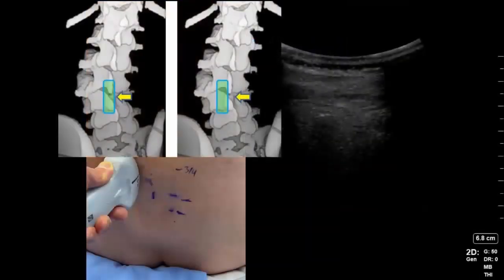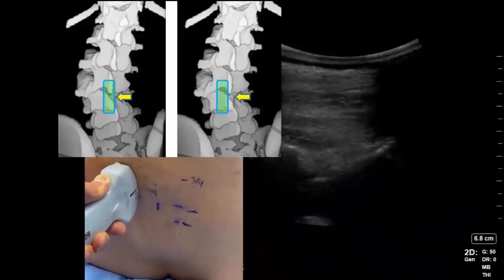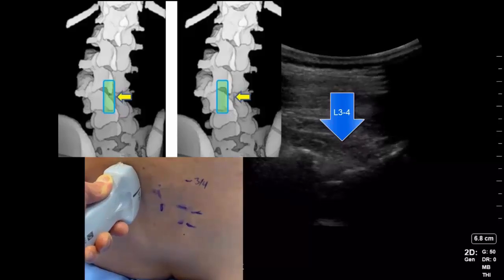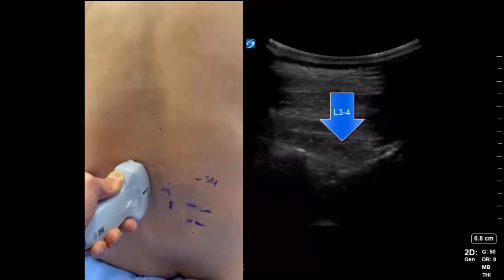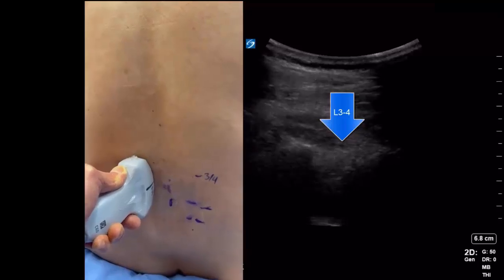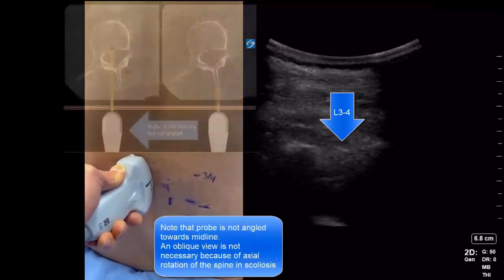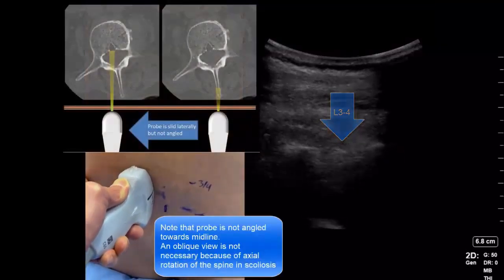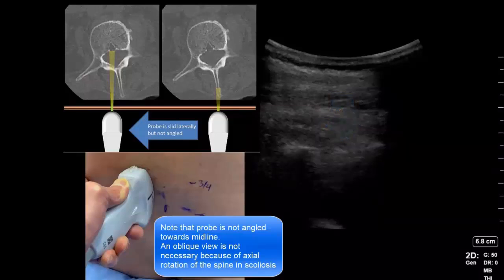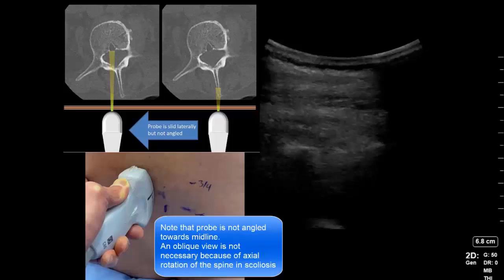If we slide the probe to the left at this point, the beam will once again enter the paramedian interlaminar window and give us a view of the anterior complex of the L3-4 space. Note, however, that to obtain this view, the probe does not have to be tilted towards the midline as is usually necessary. This is because of the rotational scoliosis that always accompanies the lateral curvature. This rotation allows the ultrasound beam to enter the canal in a strict parasagittal plane without the need to angle obliquely.